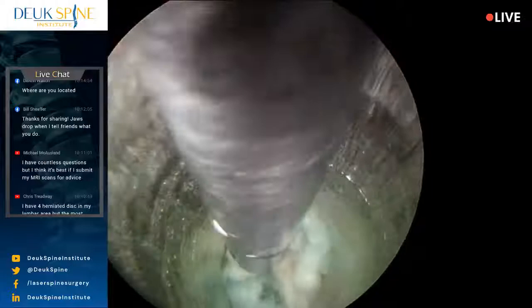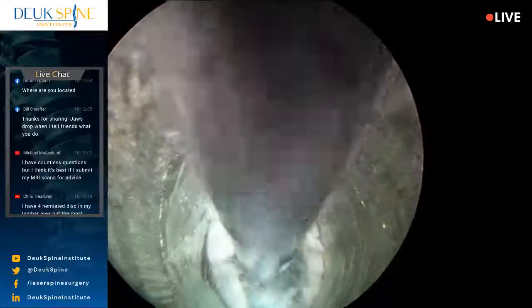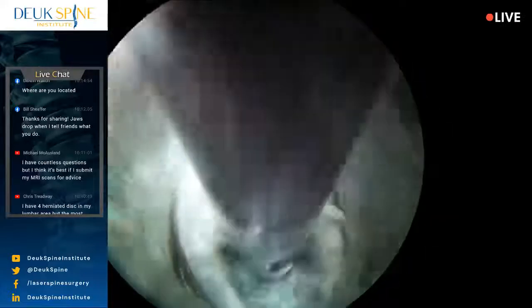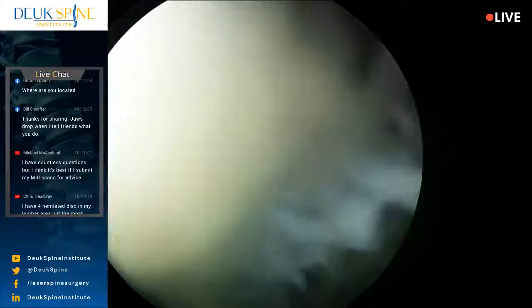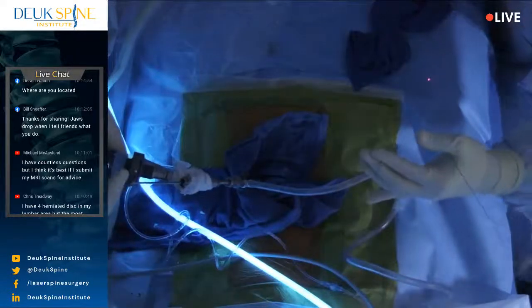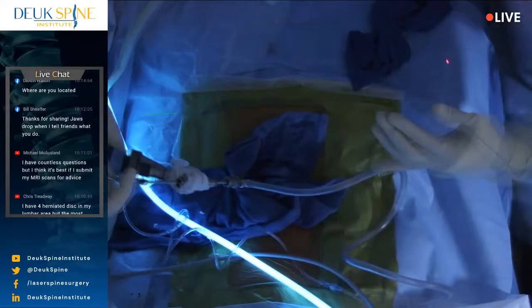All right, I've got to reposition my tube to look down the annular tear. We're almost done. I think we've got 5 minutes left, maybe. Oh, that's a nice herniation piece. Doctor, I don't know if you heard me, but yes, 5 minutes.